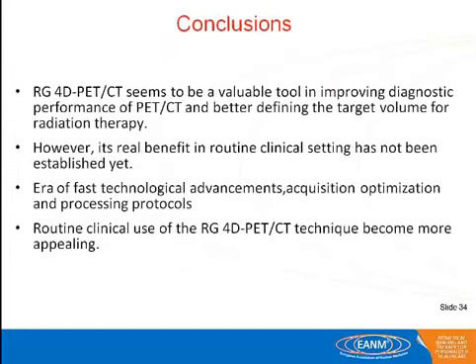treatment session. So as a conclusion, respiratory gating seems to be a valuable tool in improving diagnostic performance of PET and better defining the target volume for radiation therapy. Actually, we don't know if there is really an improvement in patient survival. That's still not known.